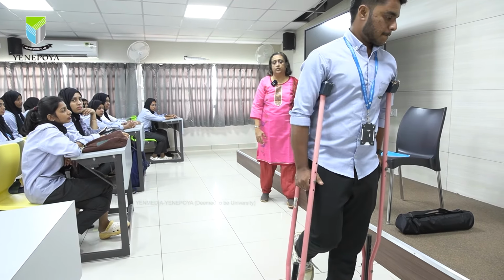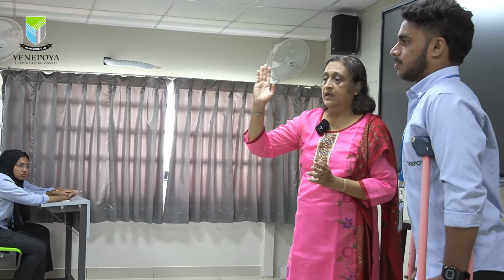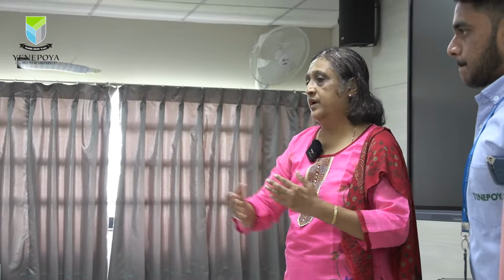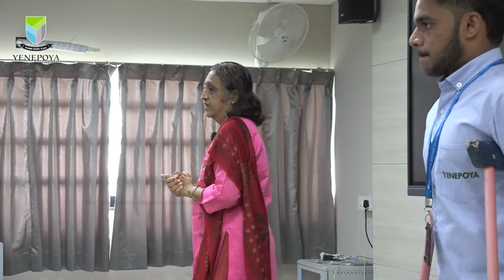This is the faster pattern the patient is showing, and it is easier for him to walk faster. When his leg is passing through the border of the crutches forward, it is called a swing through gait. If his leg is within the border of the crutches, it is called a swing to gait. And these are the patterns with the 3-point gait the patient is showing.